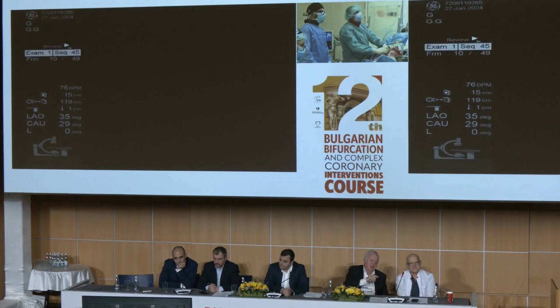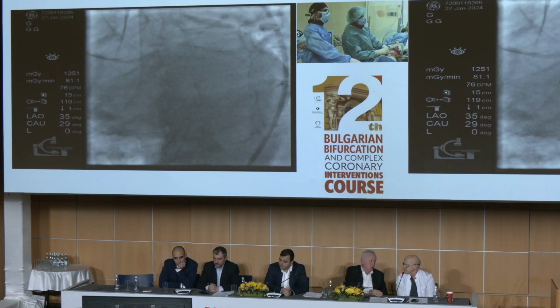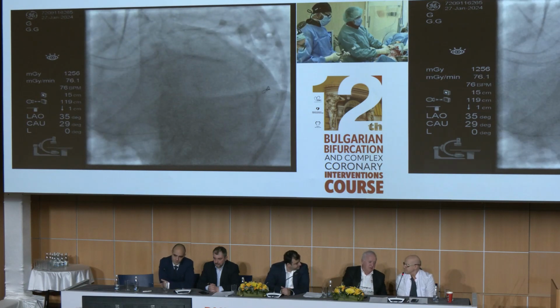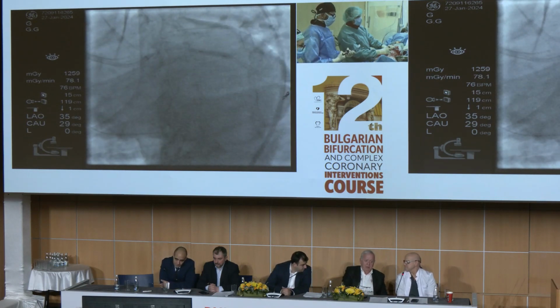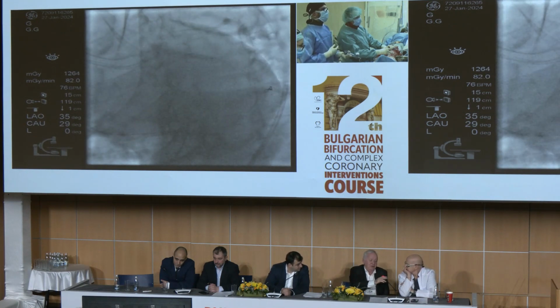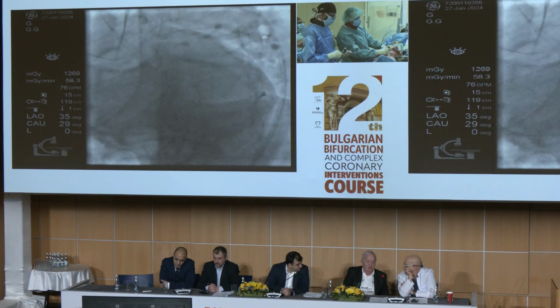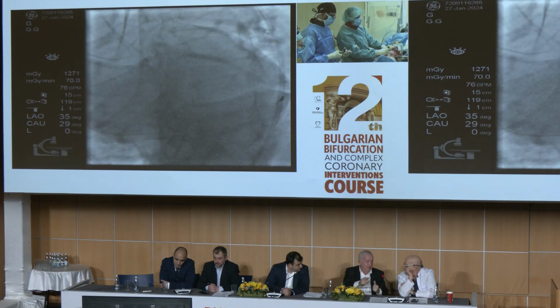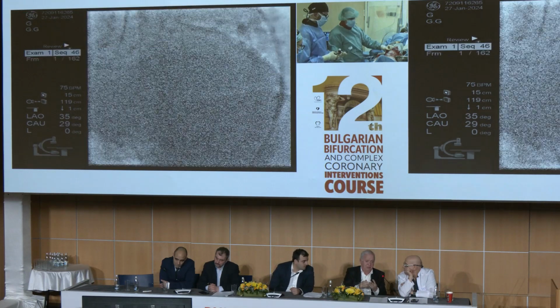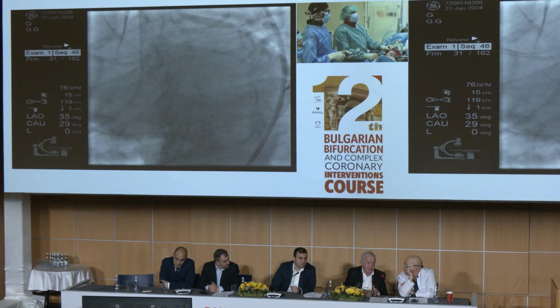And we have the result for bifurcation from October last year, discussed at EBC, which was of course greatly in favor of using OCT versus angio guidance. But the recommendation was 5 pages in the paper, 5 pages, of recommendations for guidance with angiography.